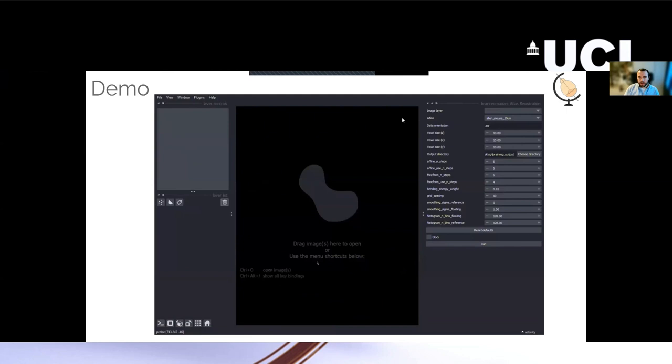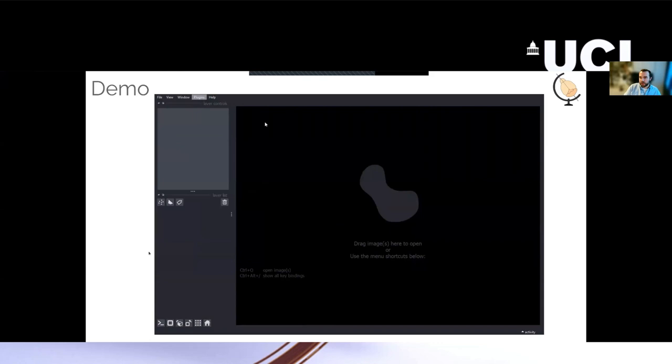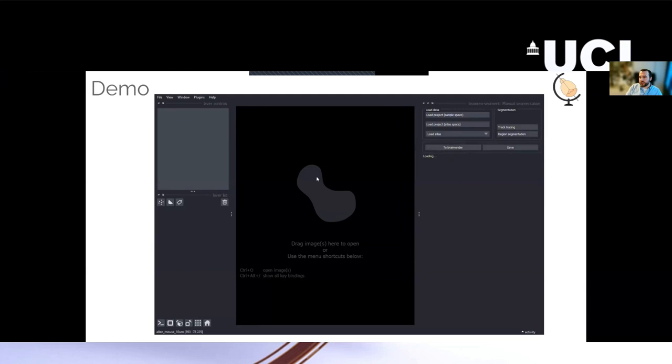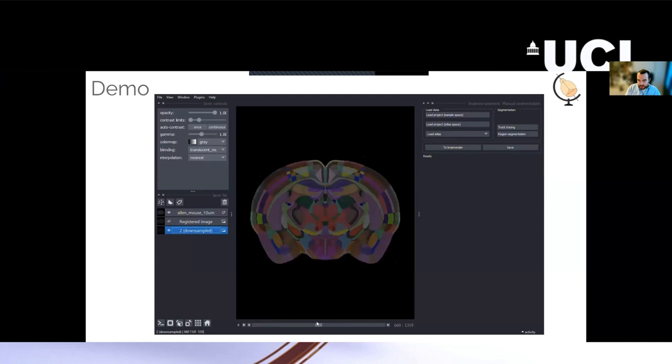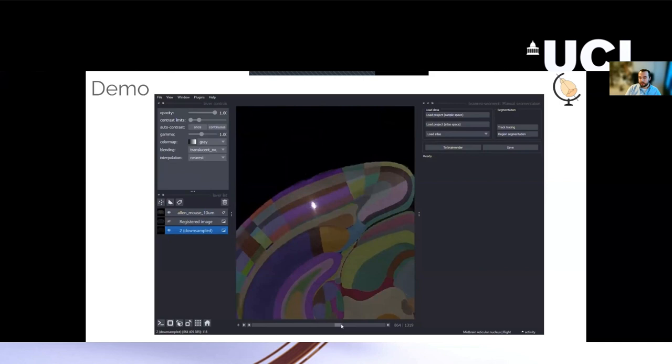Open up this other plugin called BrainReg Segment that takes in the output of the BrainReg plugin. And you can do this analysis either in sample space, with the atlas overlaid onto your image, or in atlas space, with your sample warped to the atlas. This is often easier because if you do your analysis in atlas space, then everything you've created is already in the common coordinate space. You can pool your data much more easily. This is the same data that we registered. You can see that it just looks a little bit different because it's been warped to the atlas, so it's nice and symmetrical and looks a bit tidier. But you can still see here that the probe track is in the same place.